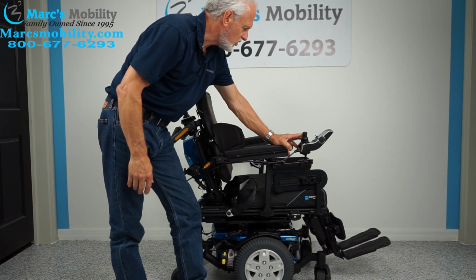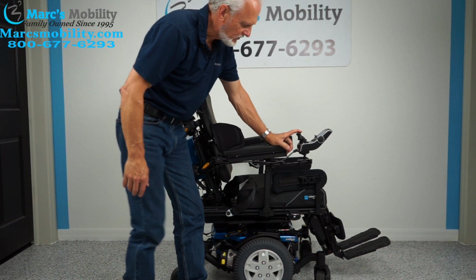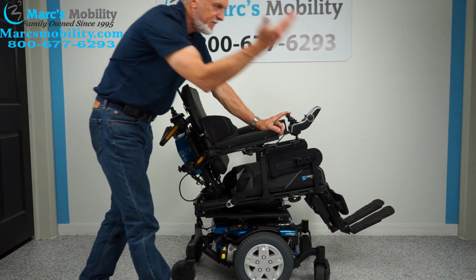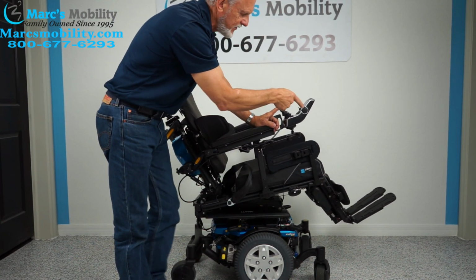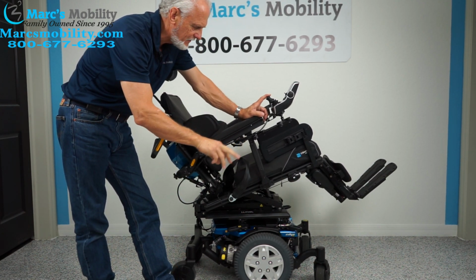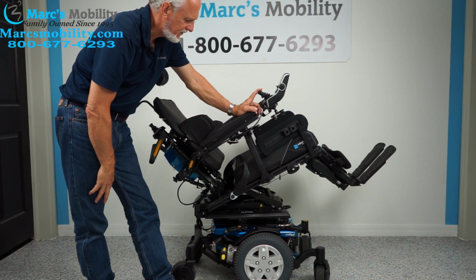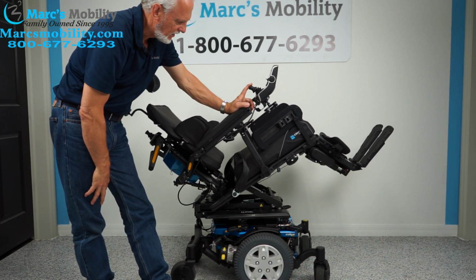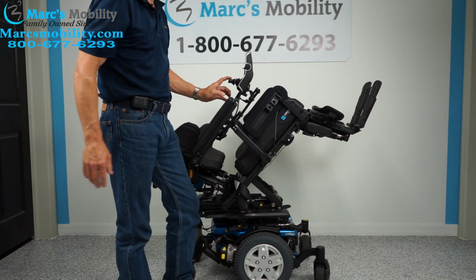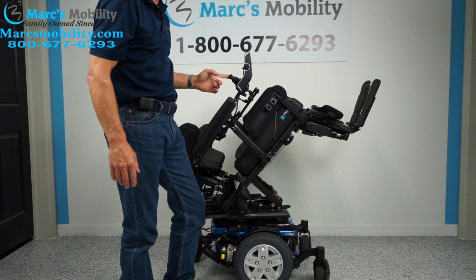The second feature I'm going to show is called the electric tilt. The electric tilt is the base right here, this bottom base. When that goes back, it's going to take the legs, it's going to take the back because they're all connected together. This is called the electric tilt. So if you need good circulation, there you go. Now watch the feet also. I'm going to move the feet up.